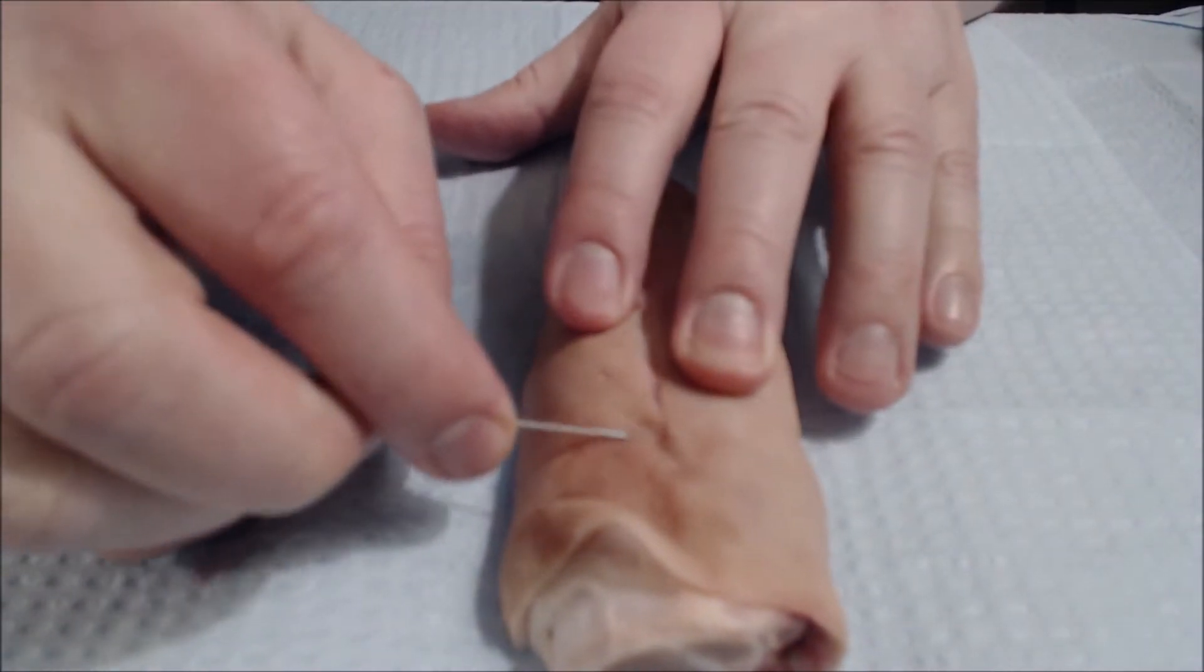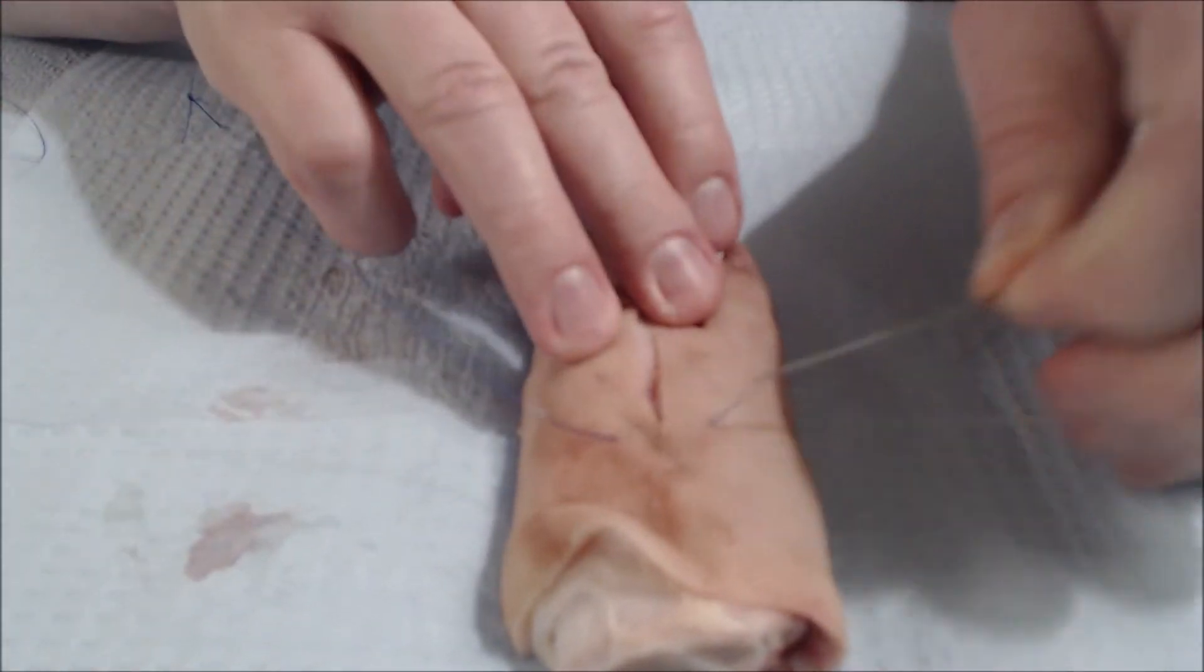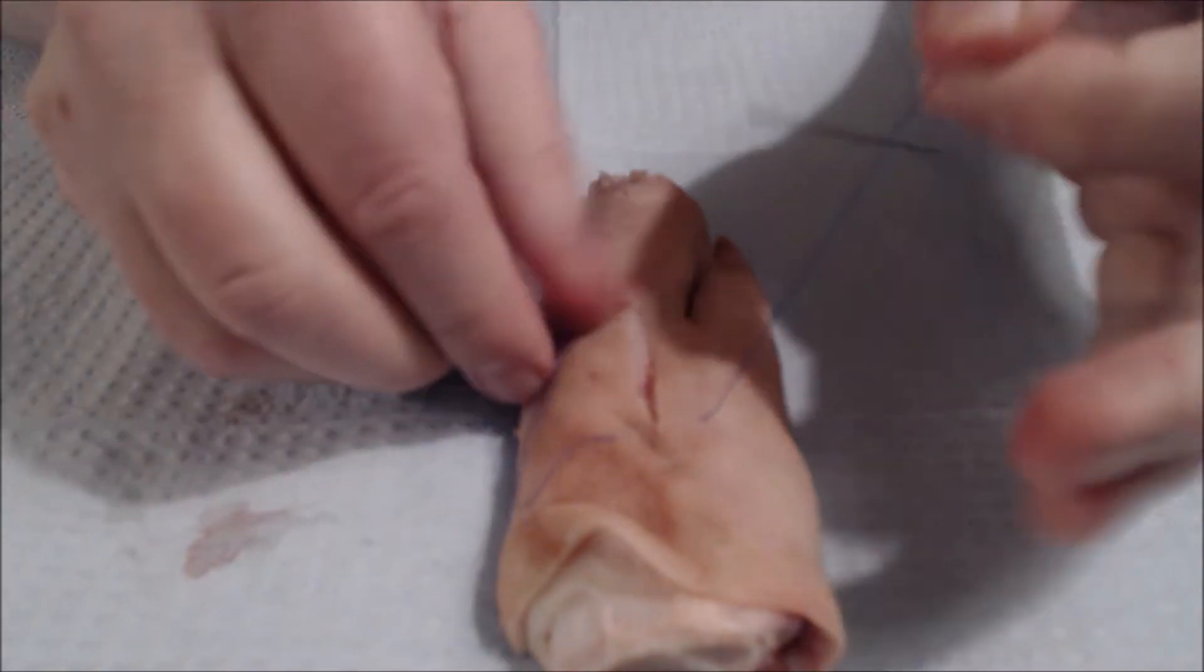The reason you might want to lock sutures is because it helps stop the bleeding. It's essentially a watertight seal.